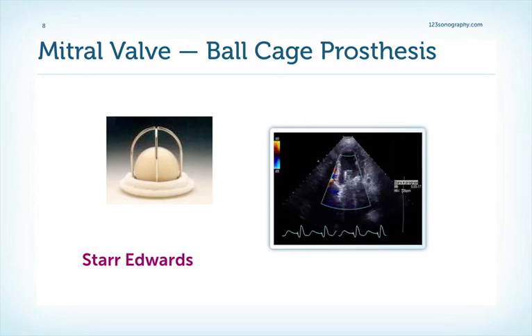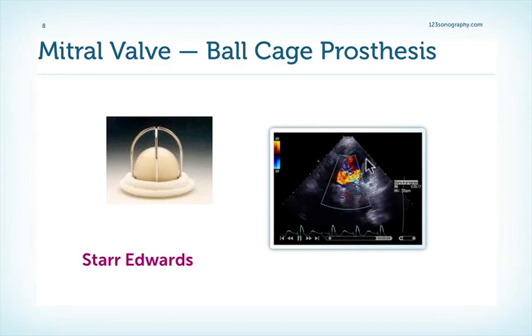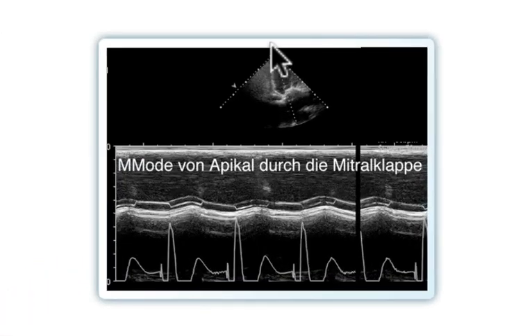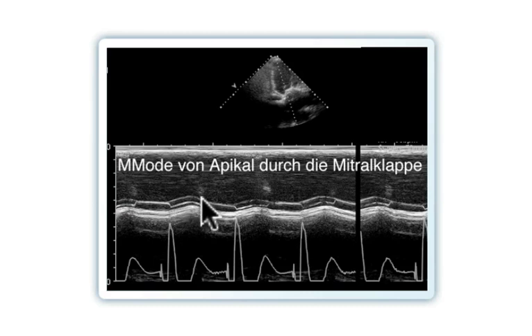Here is the same valve now with color Doppler. The typical finding is that we have flow around the ball, which is usually of fairly high velocity, so we have aliasing. Probably the best way of assessing the opening and closing motion of cage ball valves is with M-mode. You put the M-mode ray from the apical position right through the valve, and then with the help of the ECG you can delineate systole and diastole. This is systole, and here the opening position of the ball is nicely visible, while this is the closed position. You can see it move back and forth very nicely throughout the cardiac cycle.